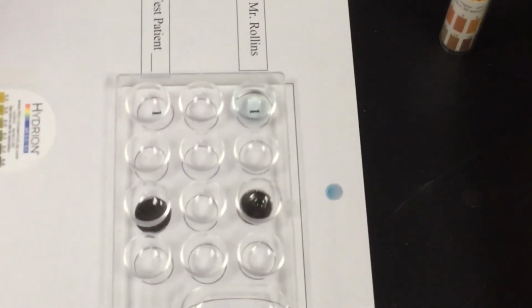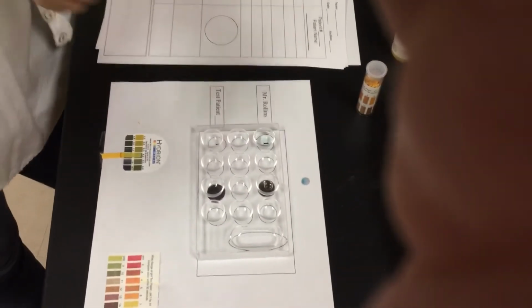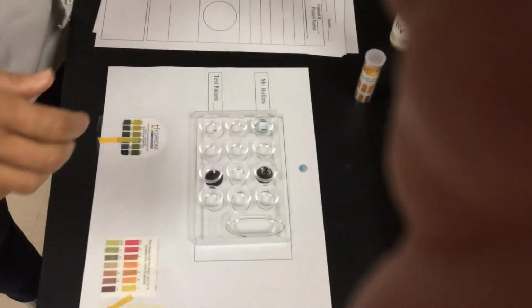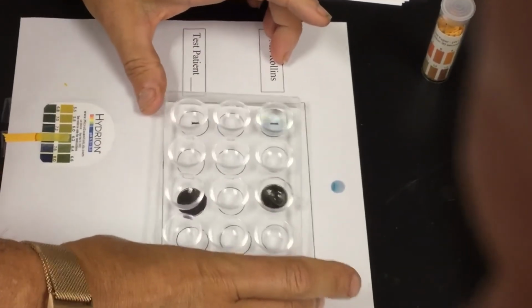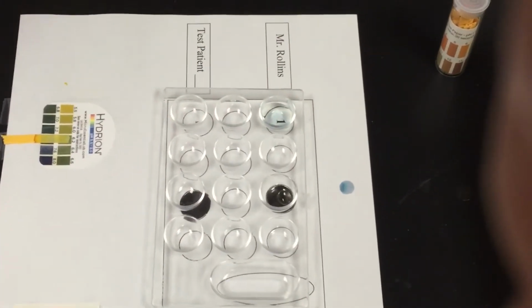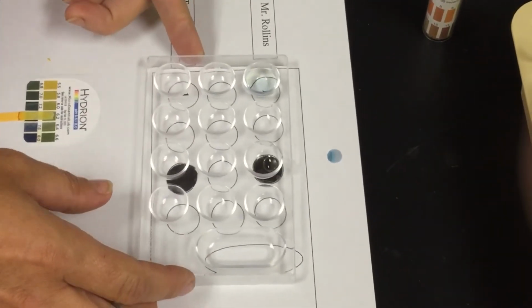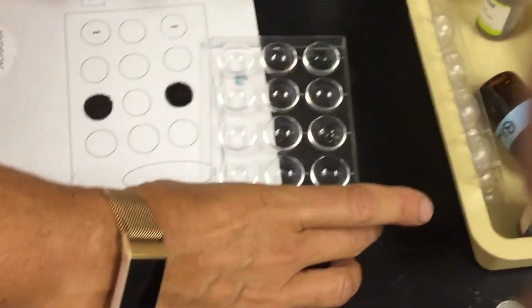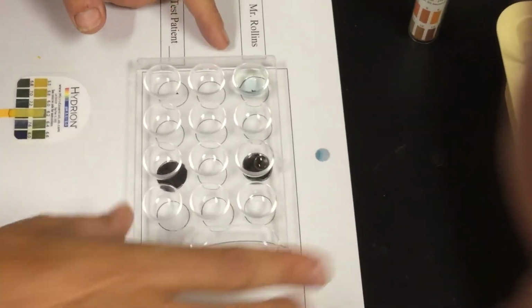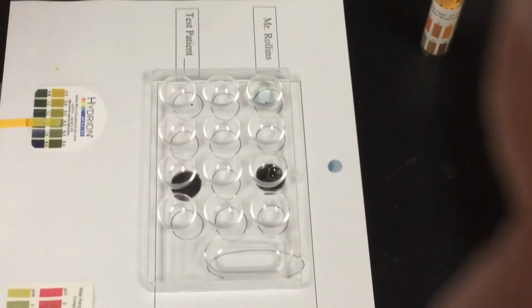I can now look at my chlorides. So I have 1 drop on there, and I put it on the black surface because if it is positive for chlorides, you're going to see a white precipitate that actually forms. It's going to look really, really cloudy in there. So I'll add my 1 drop of chlorides, give it a little tap, and if that had turned cloudy, you would physically see it. And I'll put some examples on Google Classroom so you guys can see some pictures of positive test results versus negative test results. So that, I'll put it up here too, you can actually see is still clear, nothing in it. So we're going to go through. I would say my chlorides are negative there.